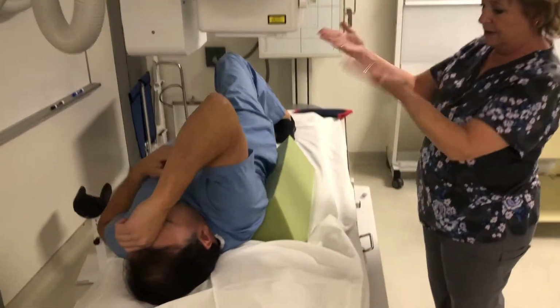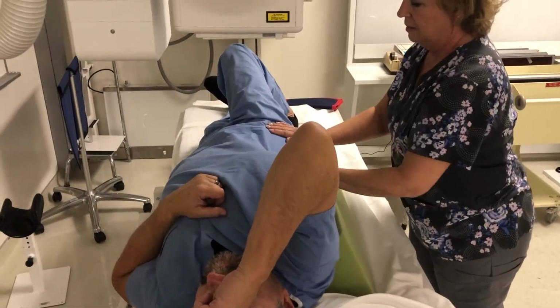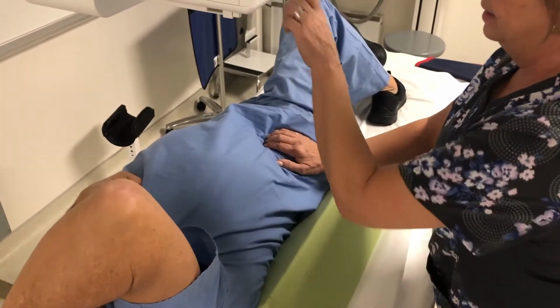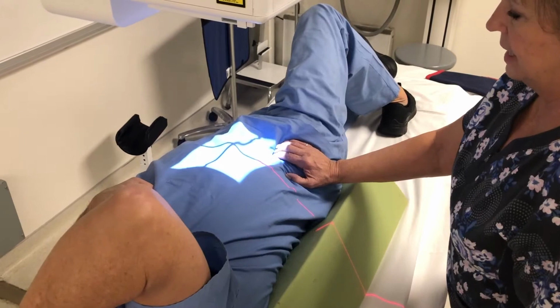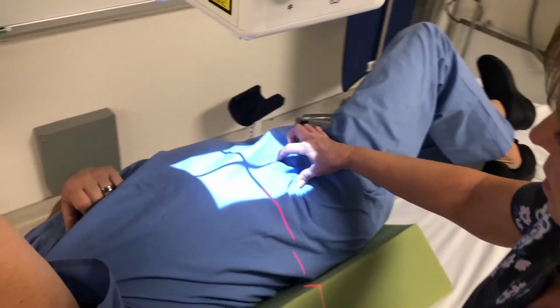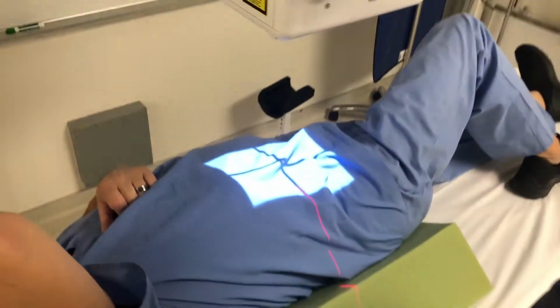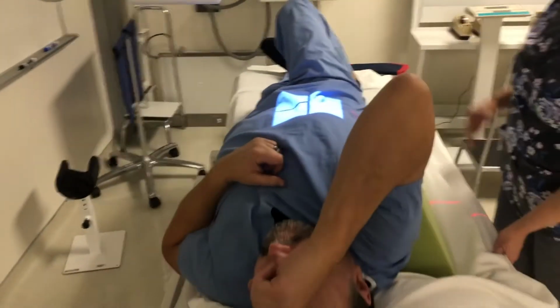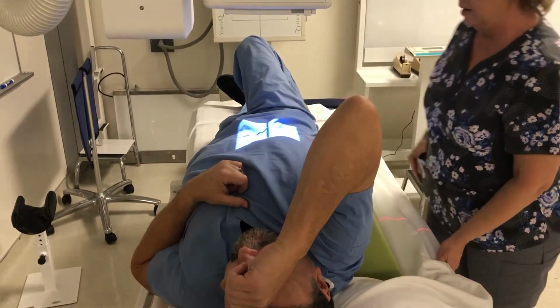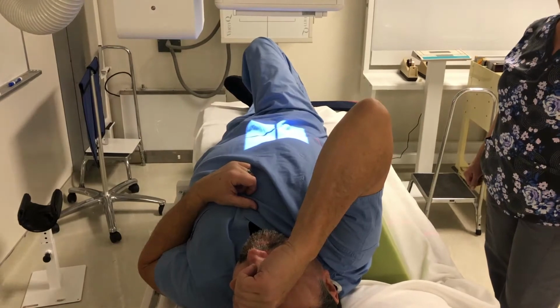No need to pull this out and recenter because the collimation is the same. I'm going to feel for crest and ASIS. Okay, slightly above the level of the crest and about 2 inches medial to the ASIS. And again, we can look at his spine and gauge that we're in the right position. So if I follow his spine down, I should be right on it. Okay, so suspend breathing and expose.